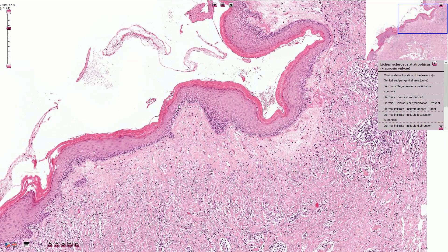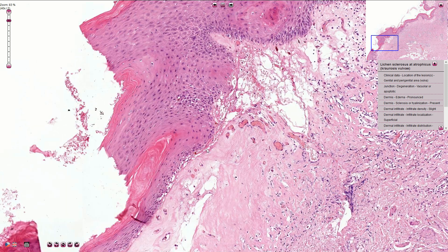dermo-epidermal junction is quite linear without papillary structures. In some areas we can find vacuolar degeneration at the dermo-epidermal junction, and this sign is more prominent in early lesions.